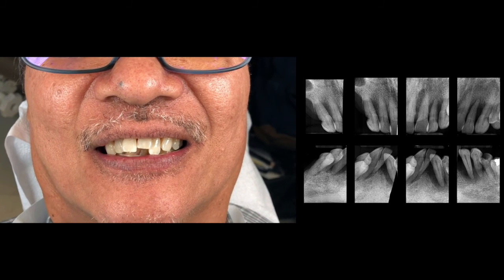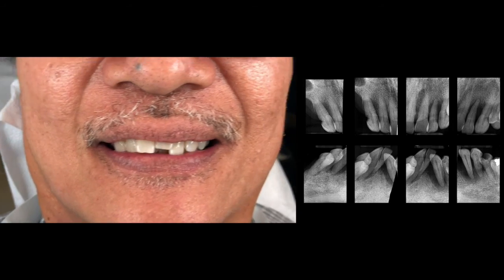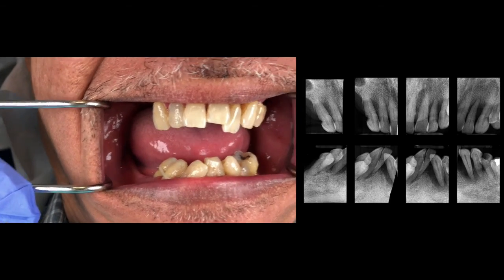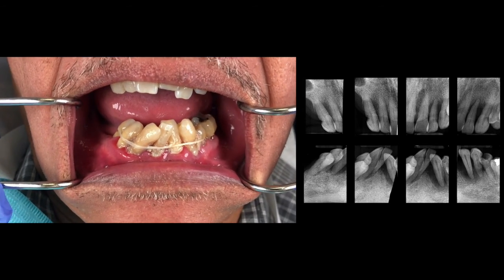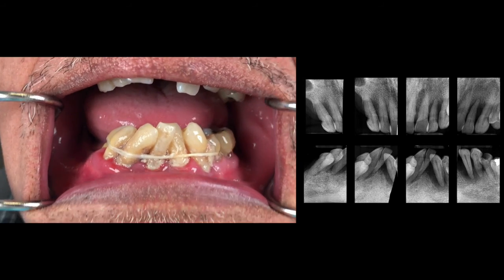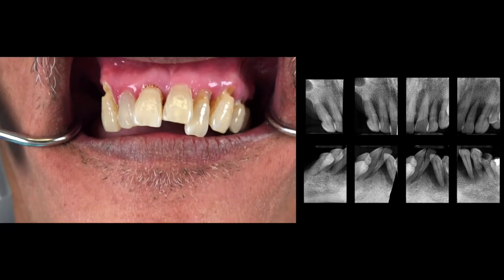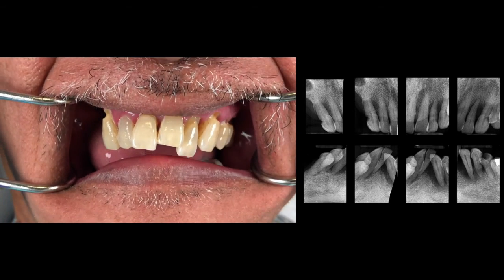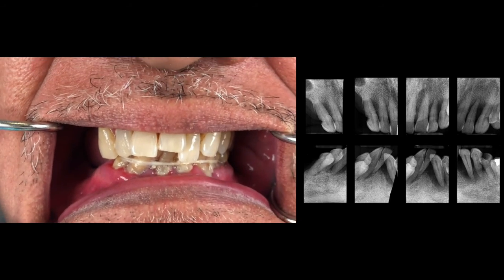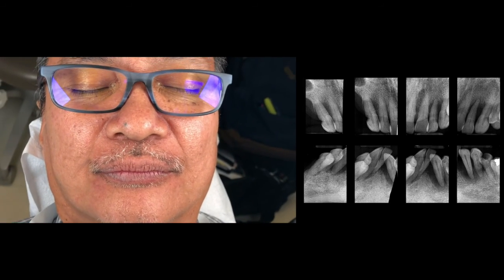Retract the mouth. Yeah, with the metal. Like that. Okay, and just the lower first. There we go. And upper. Retract up further a little bit. Thank you. And in the middle. Close tight. You take it out.